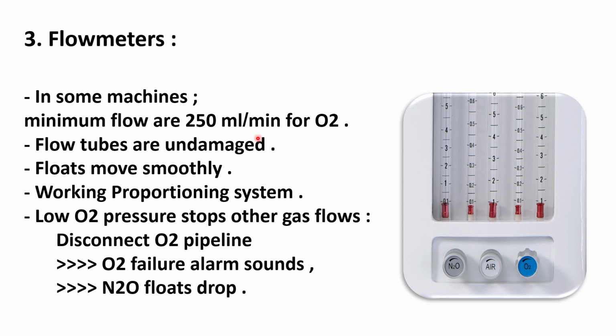Okay, and we should check that the flow tubes are undamaged, floats move smoothly, not cracking with the tube, and at low oxygen pressure other gases stop. If you disconnect the oxygen pipeline from the wall or from the anesthesia machine, you will hear the oxygen failure alarm and the nitrous oxide float will drop. Why does it drop? Because of this proportion system.